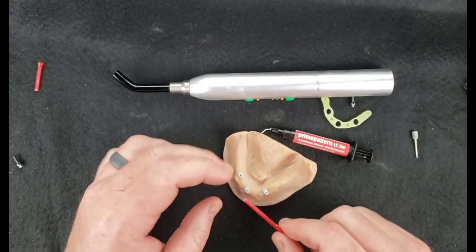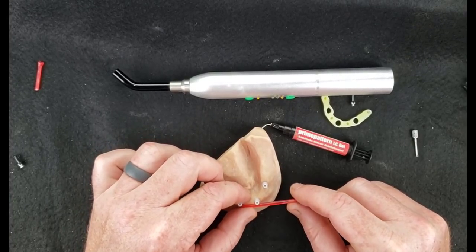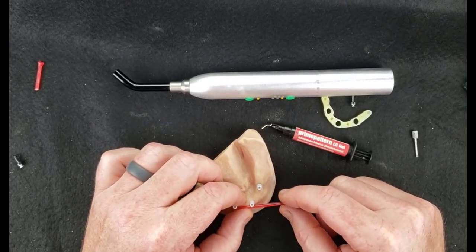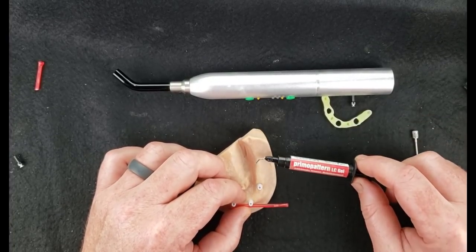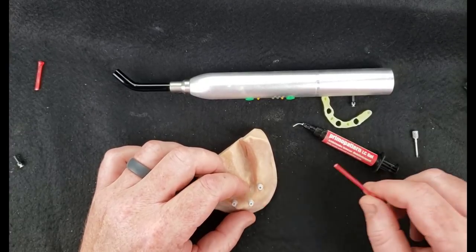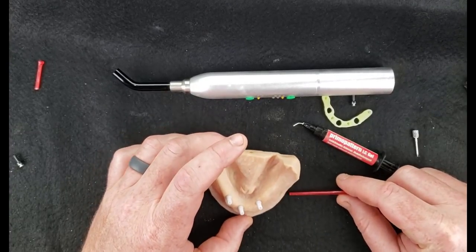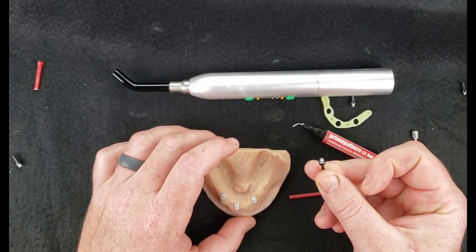Same process. If you're going to do this by hand, just take some spans of this, put it across here, and then just shape your bar directly out of Primo pattern right on top of your model here. Obviously lock it around here on your UCLA abutments and cure it, and then lock in your cast 2 locators here as well.